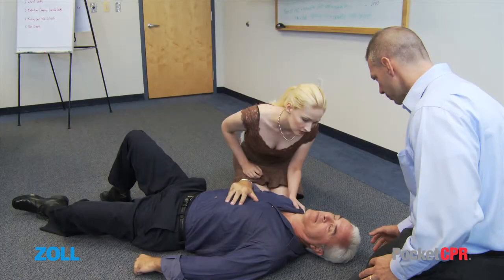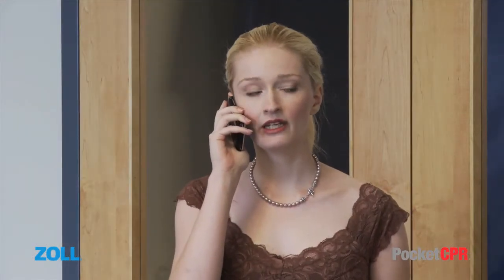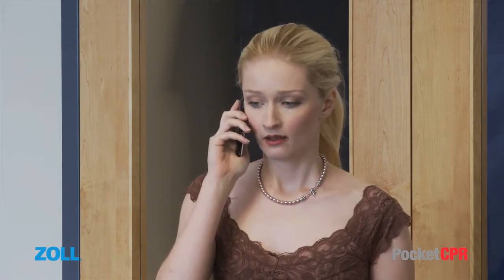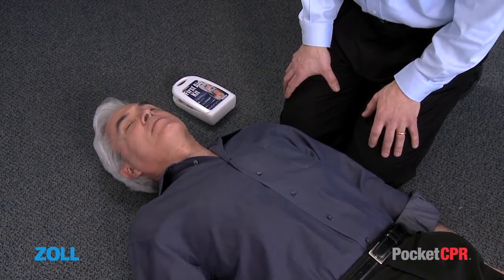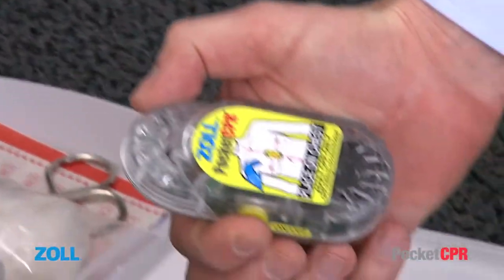When you see someone who is unconscious, immediately call emergency services. We have a man who's collapsed. He's not breathing. Or tell someone else to call emergency services and to bring a defibrillator if one is available. Make sure the scene is safe from further potential injury to you or the patient. Turn on the PocketCPR by briefly pushing once on the yellow power button.